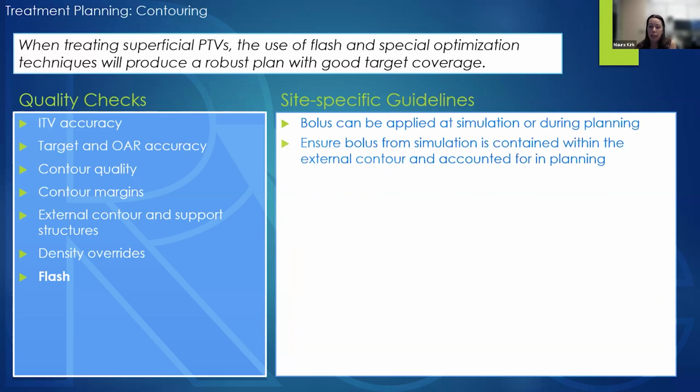Bolus can be applied at simulation or during planning. You just want to ensure that the bolus from simulation is contained within your external contour and accounted for in planning, and make sure everything is communicated in a consistent way.